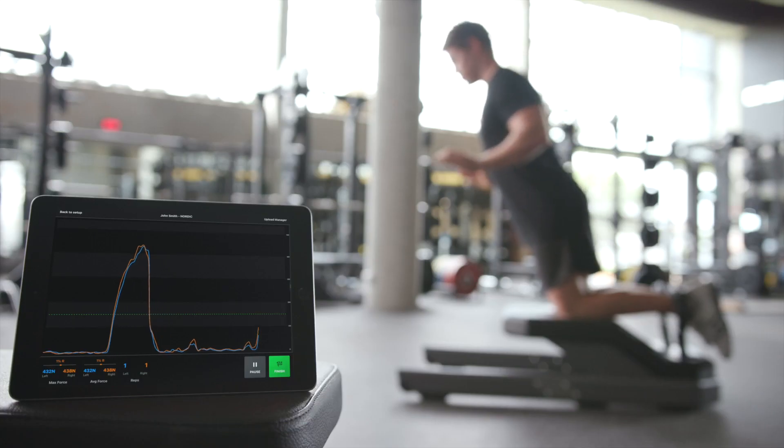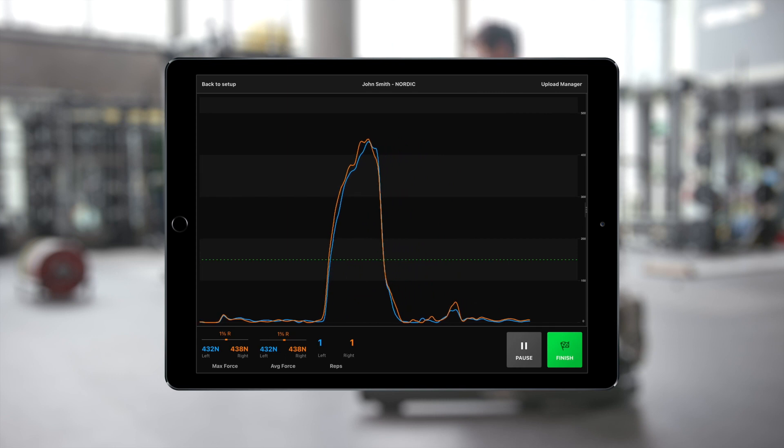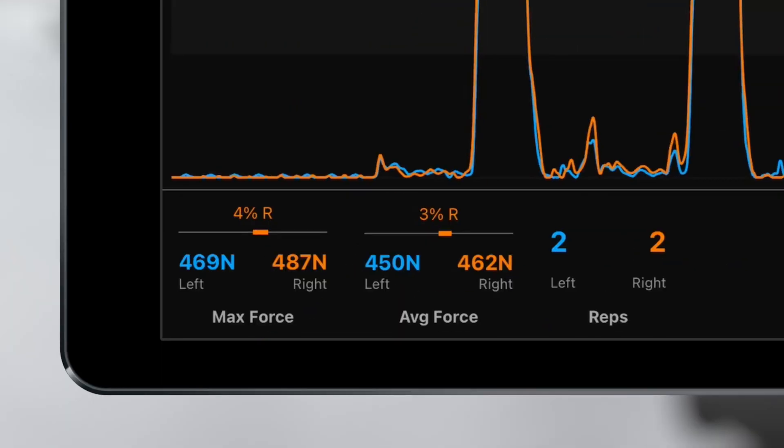The NordBoard app connects via Bluetooth to make data collection easy. Capture test data in under 60 seconds with a live force trace, which shows hamstring strength in newtons for the left and right leg. Maximum strength for each repetition and average strength across all repetitions is also highlighted for quick review.